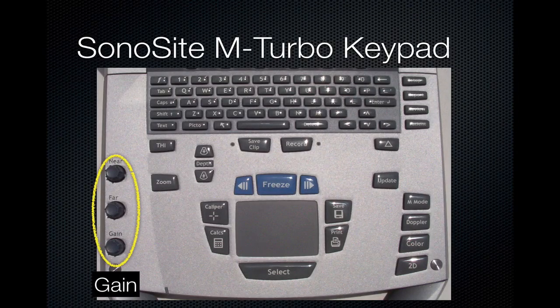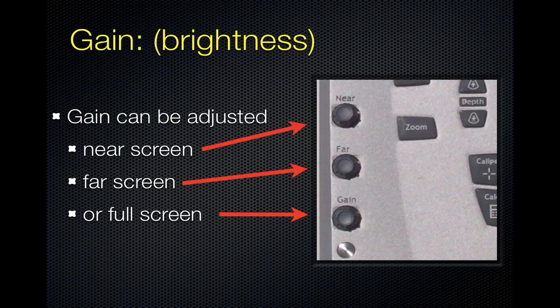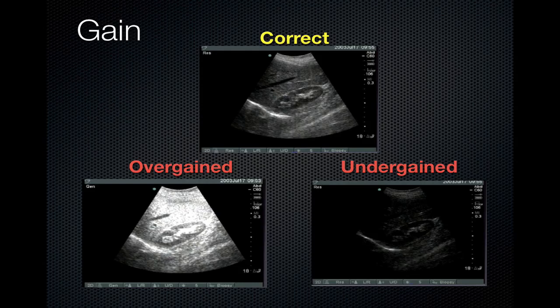Gain is brightness. The buttons to adjust gain are typically located to the left of the Sonosite M-Turbo keypad. Gain can be adjusted in the near field, the far field, or the full screen all at once. Here are examples of correct gain and incorrect gain. With correct gain, structures are clearly delineated from one another — the cortex of the kidney is slightly darker than the parenchyma of the liver. An over-gained picture appears snowy and detail is lost. Under-gained pictures are too dark, and one cannot discern details or differentiation between structures.